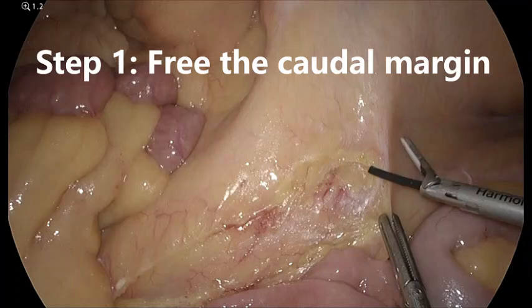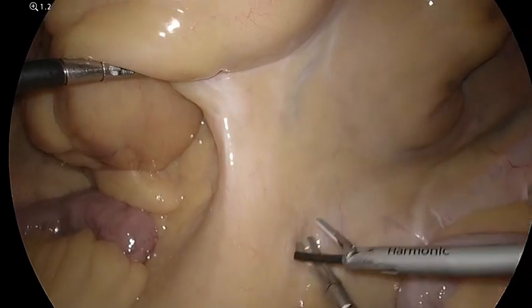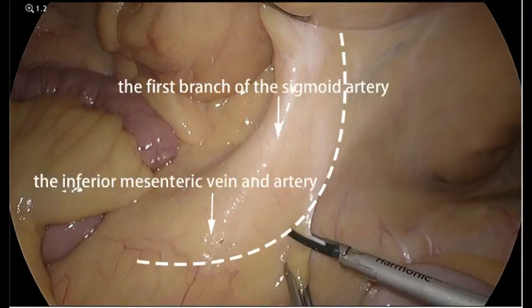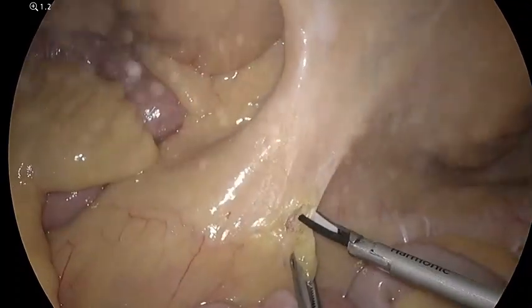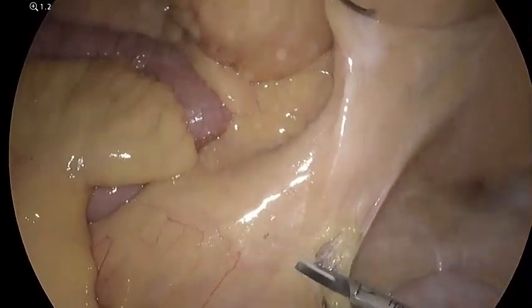Step 1. Free the caudal margin. The caudal boundary for the incision is marked by the first branch of the sigmoid artery. After exposing the root of the inferior mesenteric artery, dissect the artery in a retrograde manner from caudal to cranial, revealing the inferior mesenteric artery, the left colic artery, and the first branch of the sigmoid artery.